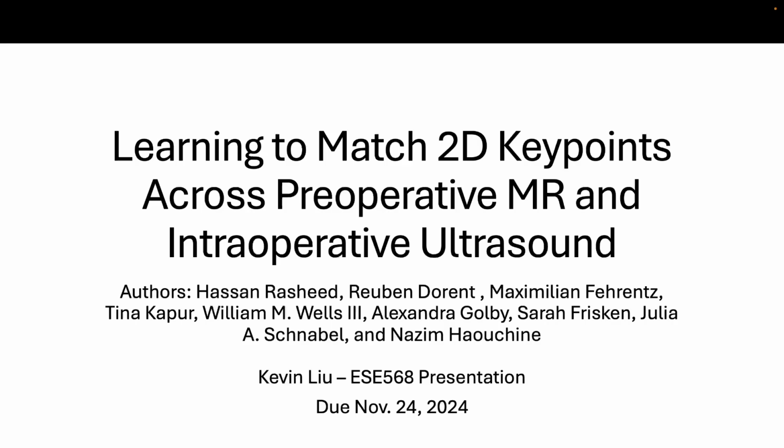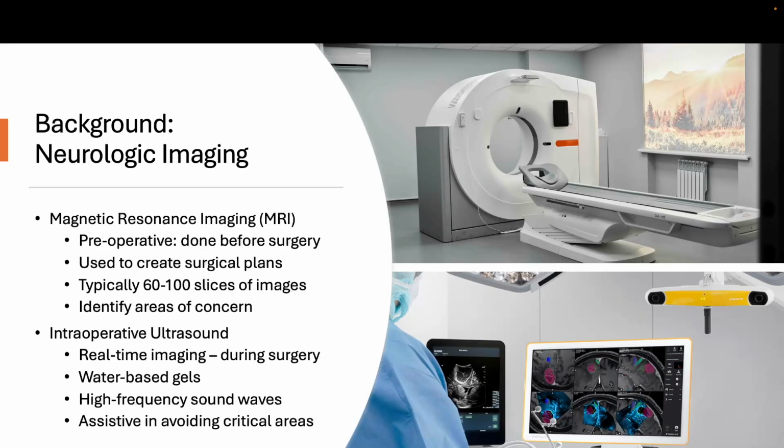Hello, I'm Kevin, and today I'm going to be talking about the research article, Learning to Match 2D Key Points Across Preoperative MR and Intraoperative Ultrasound. So to give some background, this paper mostly focuses on neurologic imaging.